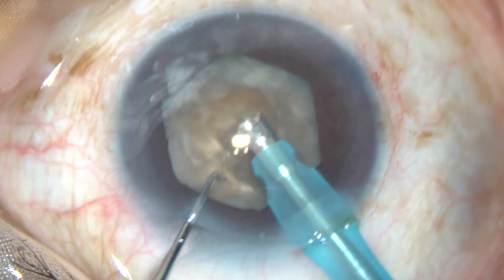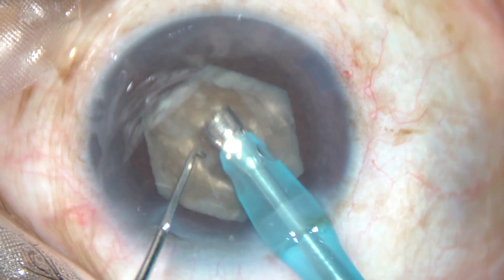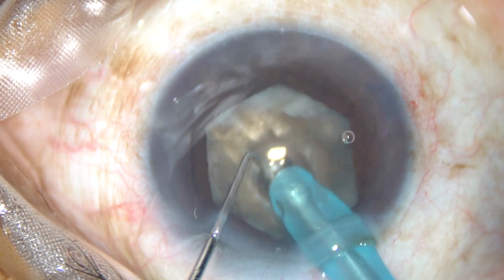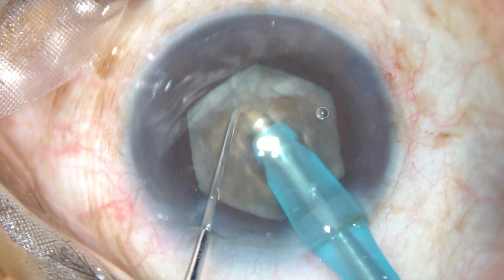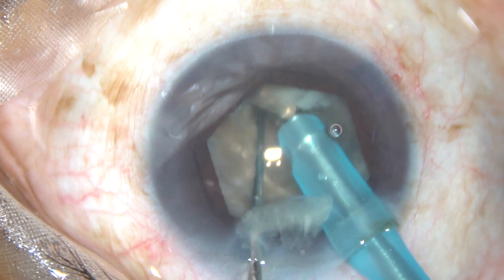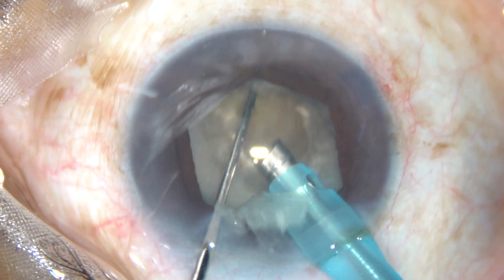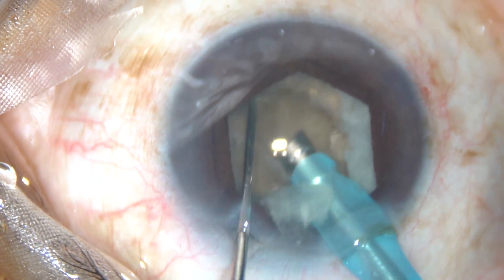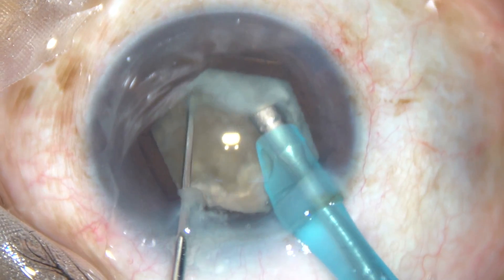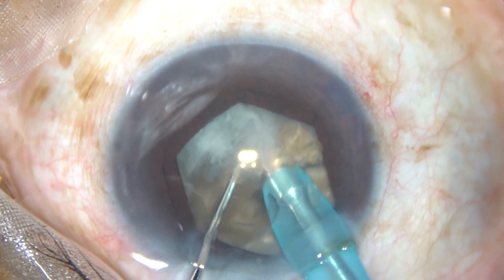Now again I go in and do some more sculpting. Then I switch to FACO2 mode. I have started chopping the nucleus and it has partially cracked. So I rotate it 180 degrees, sculpt along, hold the inferior piece, and pull the superior piece with the chopper. The nucleus divides completely into two hemi-nuclei.